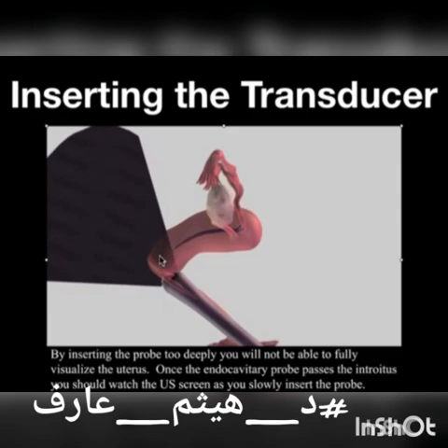And if we think about fixes for a vaginal speculum exam when we can't see the cervix, we tend to put the speculum in further into the posterior cul-de-sac, hoping to get the cervix to drop in. If we use that same type of logic here when doing the endocavitary exam, we're going to actually be counterproductive. We're going to end up with limited visualization, and we're going to cause the patient discomfort.